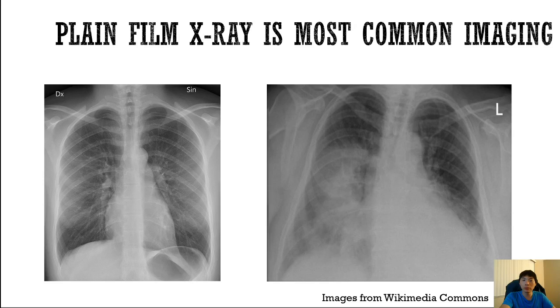This can come about due to a condition such as pneumonia, or it could indicate inflammation in the lungs. There's just more fluid than normal in the lungs, especially on the left side. On the right side of the image, which is the left side of our patient, there's quite a bit of consolidation on the lower lobe of the lung, and so from the plain film X-ray, you can tell immediately that there's something wrong with the patient.